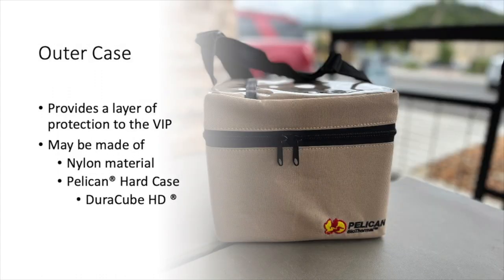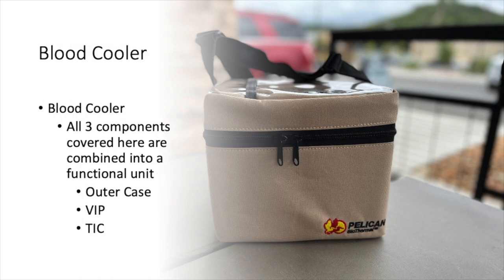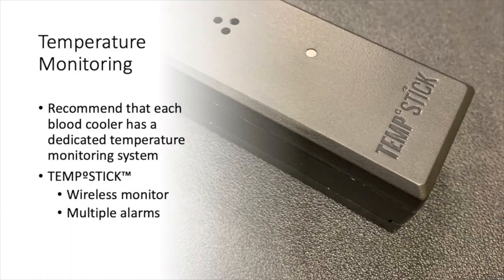The last component of the blood cooler I want to talk about is the outer case. The outer case provides a layer of protection to the VIP. The outer case may be made of a ballistic nylon material or a Pelican hard case. So our overall blood cooler refers to a top-down assembly made up of 3 individual components: the outer case, the VIP, and the TIC. Before we wrap up, I would like to quickly talk about temperature monitoring.